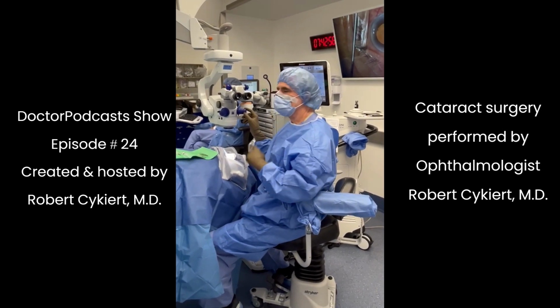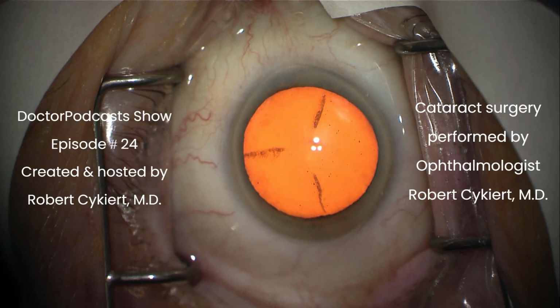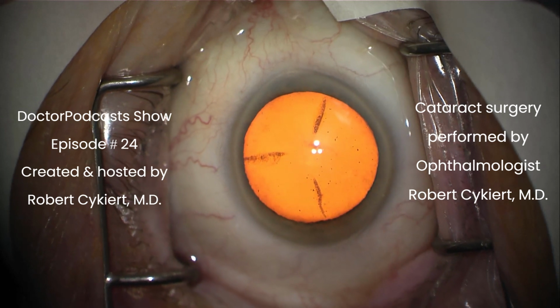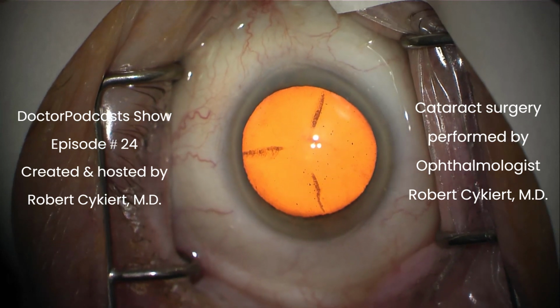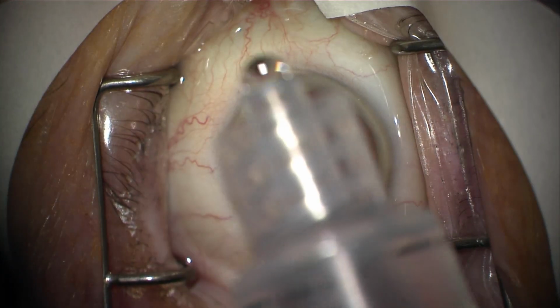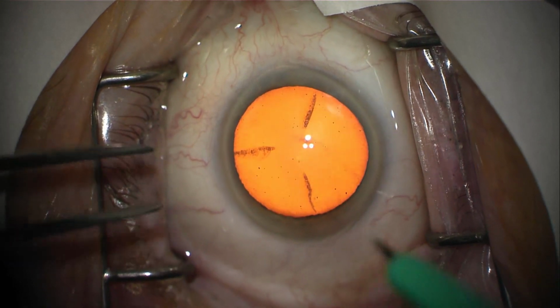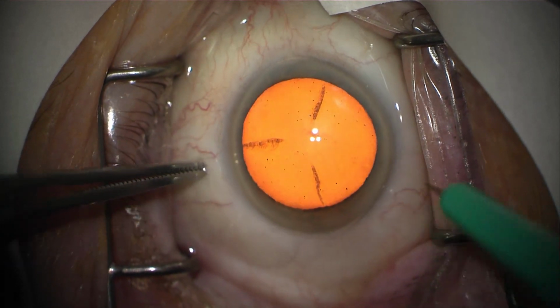Today I'm going to be talking about cataract surgery and actually be performing the surgery. Here's the patient in the operating room with their eye open. I have what's called a wire lid speculum holding the eyelids open so that the patient can't close their eye. I just applied some anesthetic to the eye. It's called 4% lidocaine, which numbs the eye.